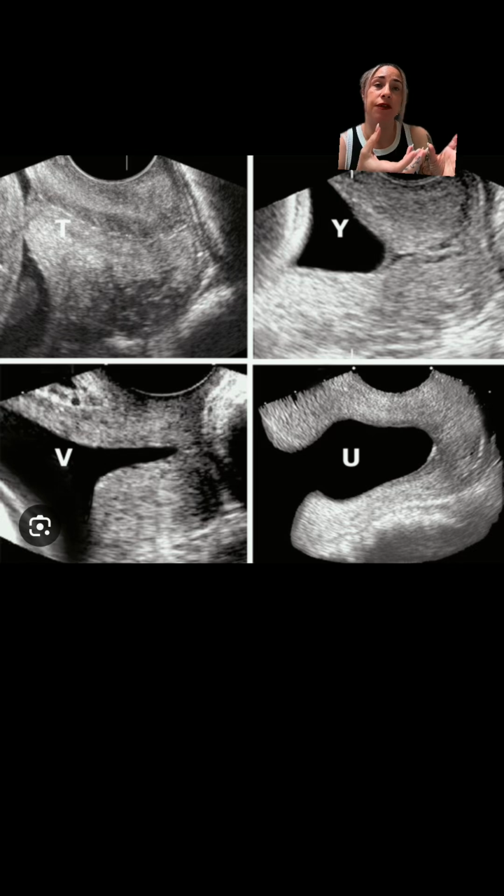And we know this is a funnel and not bulging membranes because on the bottom, towards the external os, there will be areas where the cervix is closed, right? So basically, on your whole cervical length, top left, you got some amniotic membrane coming in, and then you have closed. So that is the definition of a funnel.